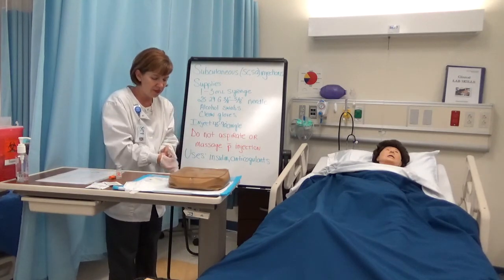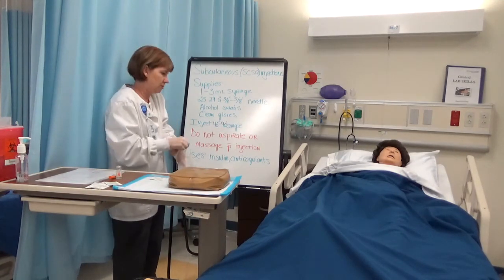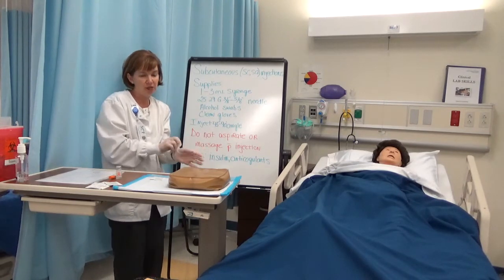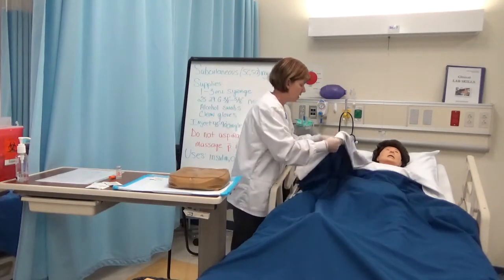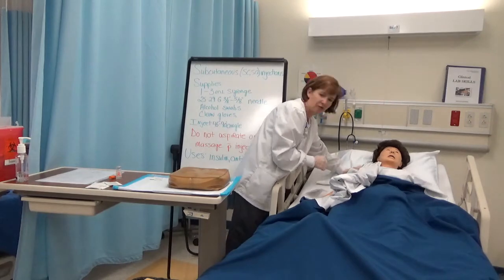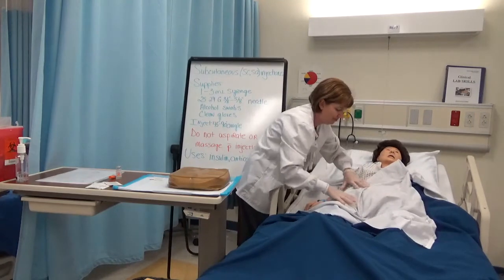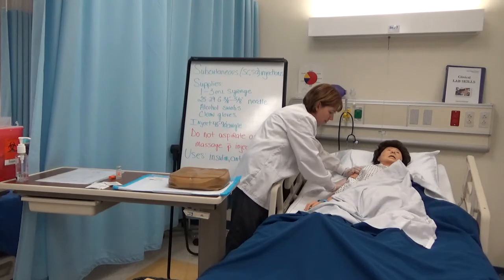The site for today that I'm going to use for Miss Cross is her abdomen. There's 3 possibilities for your subcutaneous sites. We could do the arm, and the landmarks for the arm would be to put the palm of my hand below the acromion process, and the other hand above the elbow, and it would be that area in between.